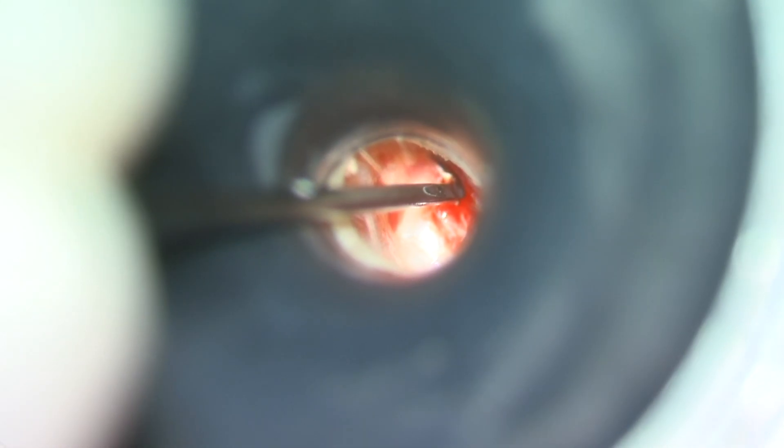We start by making an incision in the tympanic membrane along the anterior border of the cholesteatoma cyst and then dissecting it away with blunt instruments like a crabtree or a gimmick. When dissecting any cholesteatoma, especially a congenital cholesteatoma, it's ideal to keep the cyst wall intact. This helps prevent leaving any skin behind and thus helps prevent recidivism of the cholesteatoma.